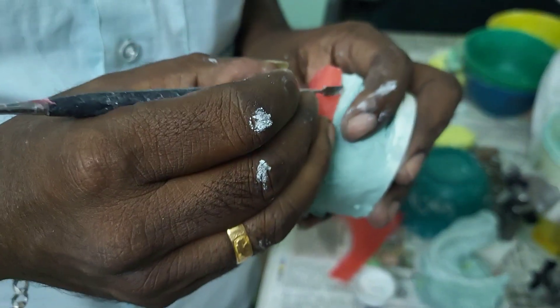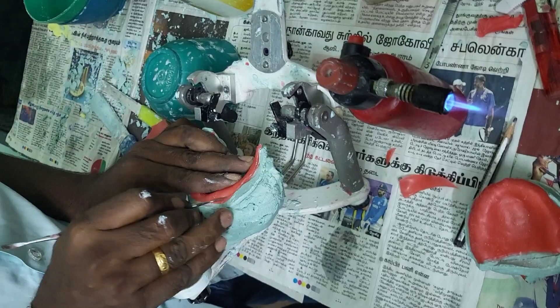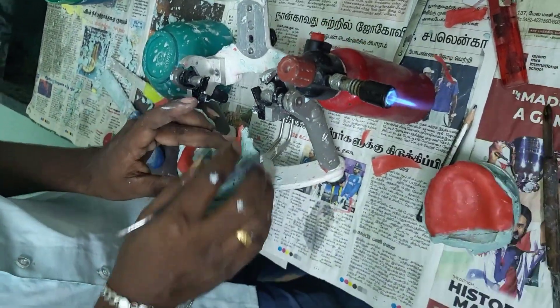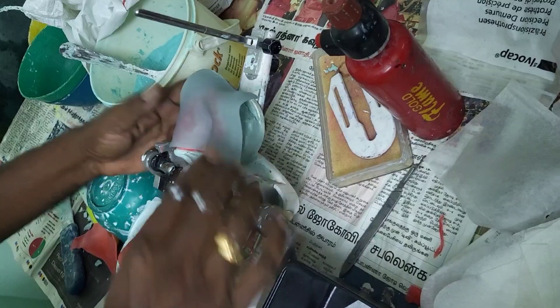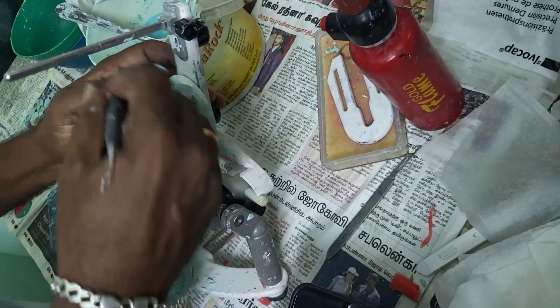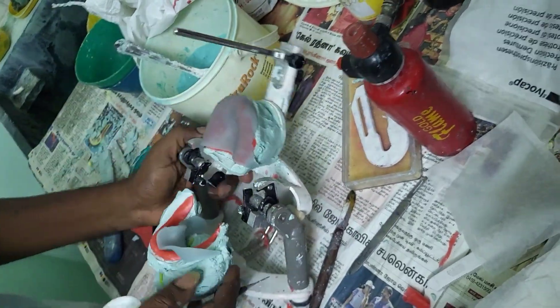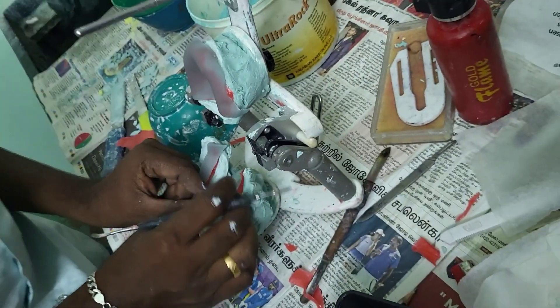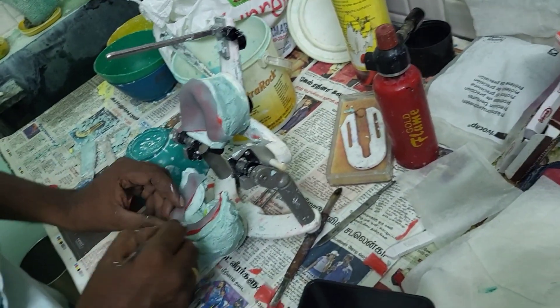This video is about how a single step border molding procedure is done using putty. The first step is fabrication of a special tray. Before that, we are adapting the spacer — a full spacer is always recommended. The special tray is made with light cure sheets, adapting the upper maxilla and the lower mandible.